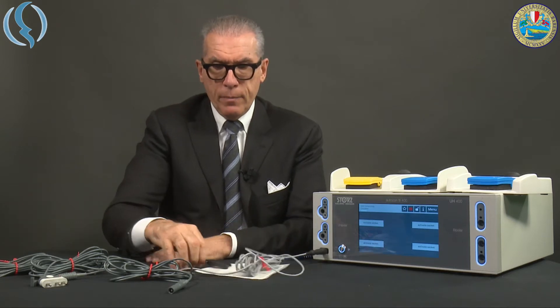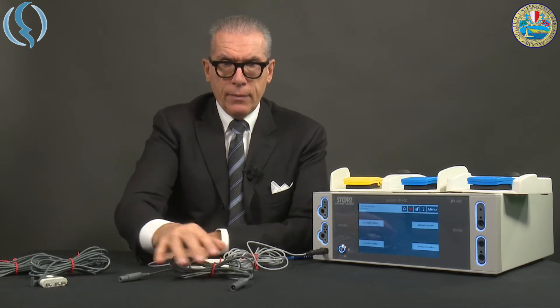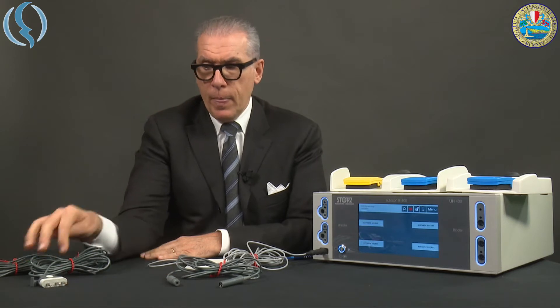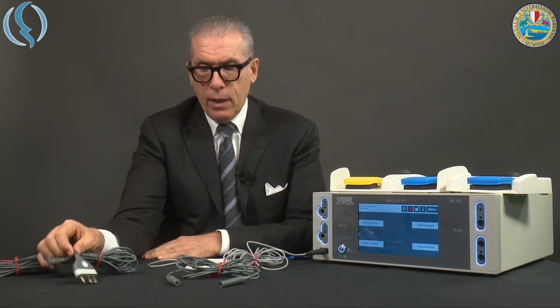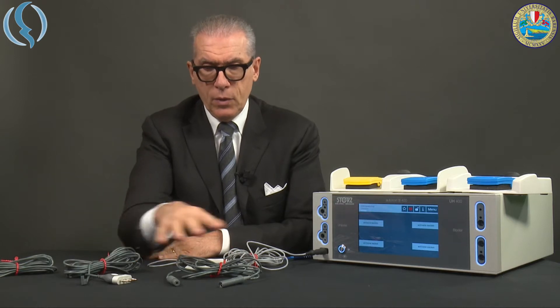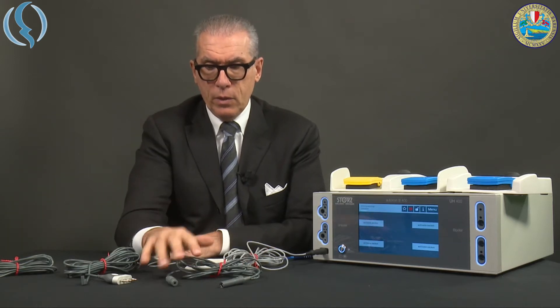We have different cables. We have a general-purpose bipolar cable, and this is a dedicated bipolar cable — you see it has totally different connectors. This is the connector on the machine, and this is the connector on the instrument.